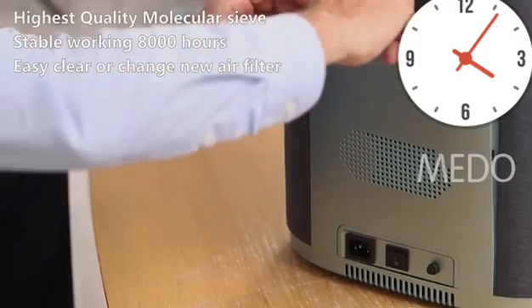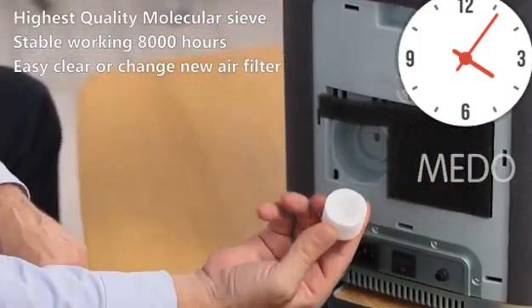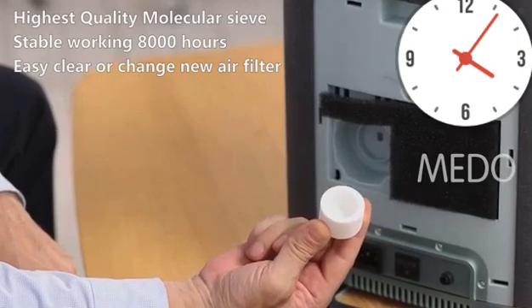Highest quality molecular sieve, stable working 8000 hours, easy to clean or change the air filter.